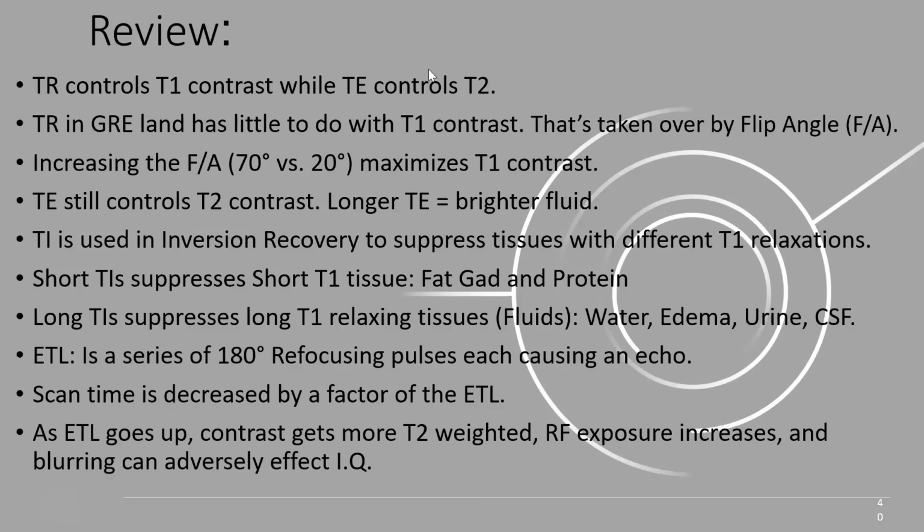Okay, so the question is, with an extremity or spine image or abdomen, for example, how do you look and know if it's T1 or T2? Well, the old adage is, when you look at an image, for the most part and in general, if you see bright fluid, it's going to be T2. If it's got dark fluid, it's T1. Now, one little caveat is when you start talking about STIR: now you've got something that's not T2, but you have bright fluid.